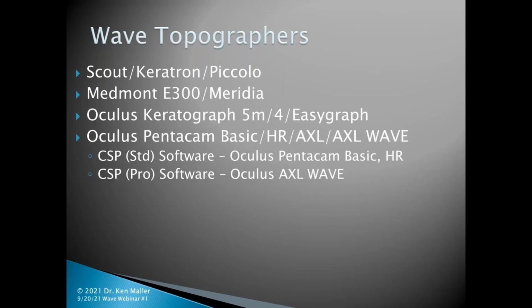The Pentacam, Basic, HR, AXL, and the AXL WAVE are all compatible with WAVE. For the CSP software, the standard software is available on the Basic and the HR, and the Pro software is on the AXL WAVE. None of the CSP will run on the AXL.